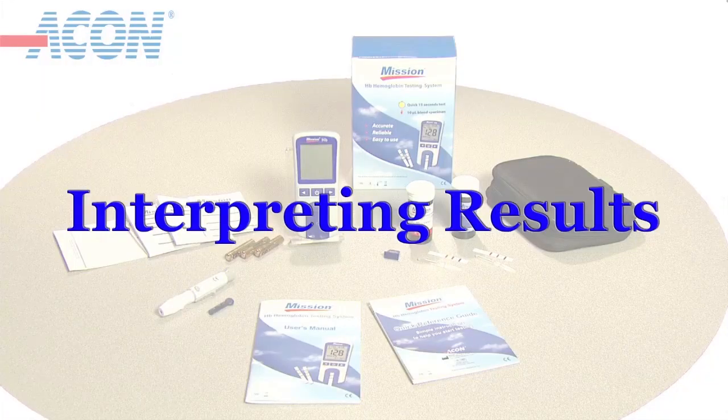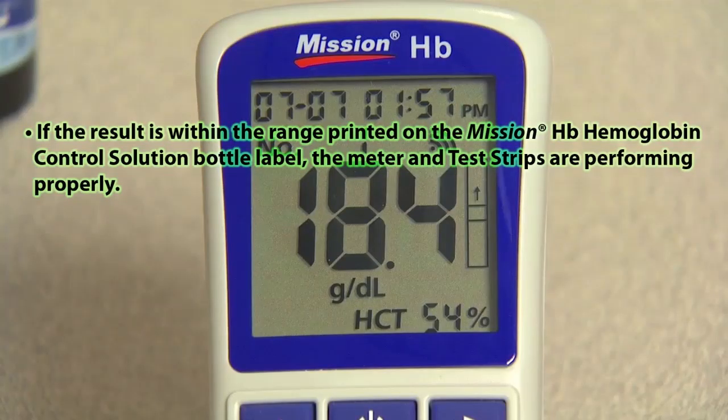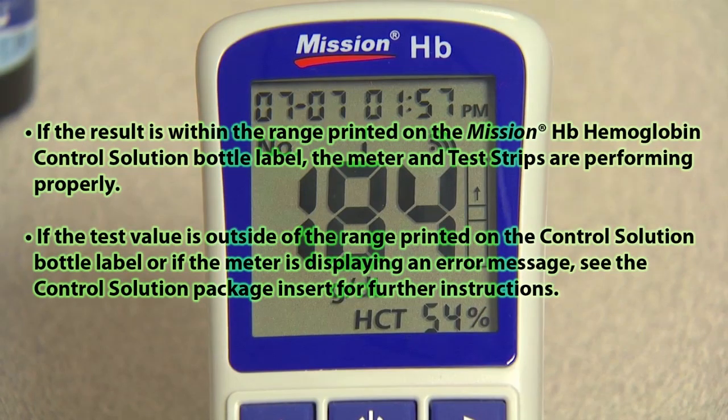Interpreting results. If the result is within the range printed on the Mission HB hemoglobin control solution bottle label, the meter and test strip are performing properly. If the test value is outside of the range printed on the control solution bottle label, or if the meter is displaying an error message, see the control solution package insert for further instructions. Please contact your local distributor for additional information.